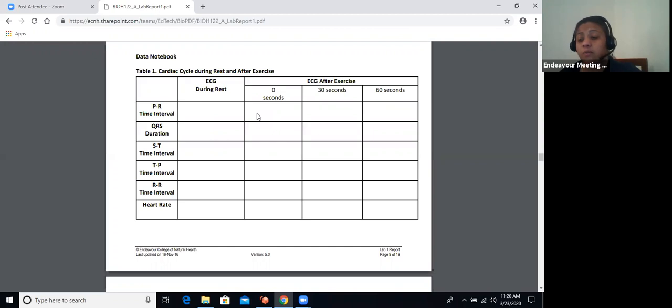health. What we actually want is that their heart rate should go at least up to 110 or above for good results. You know, if the heart rate just manipulates a little bit, you might not see a lot of changes in the amplitude of the pulse or the RR intervals or the heart rate. Okay, so it has to go above 110. So that's why we ask them to do at least 2 minutes or 3 to 4 minutes.